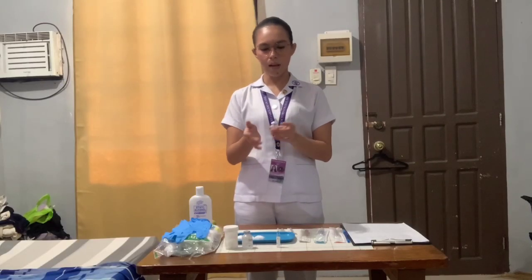So we have here our vial for the drug removal. We are going to mix the solution if necessary by rotating this vial between the palms of our hands. So we're just going to rotate it like this. And then we are going to remove the protective cap if it has a protective cap.